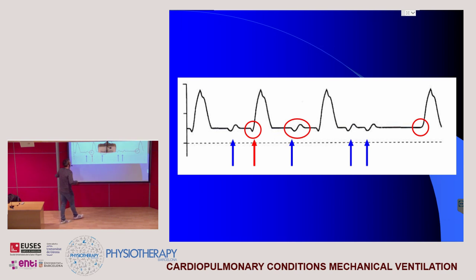And at the same time, if the patient is not able to perform a spontaneous breath, and is also not able to activate a predetermined cycle, because we have predetermined cycles, let's say of emergency or to assure ventilation, if the patient doesn't do anything, the machine will deliver by itself a predetermined cycle. Yeah. So it's a way to assure an effective ventilation.